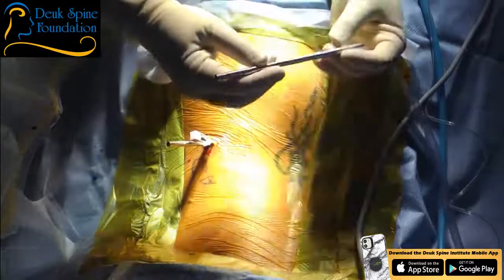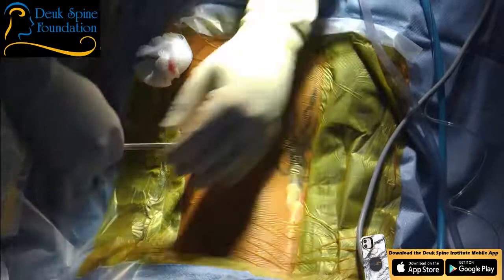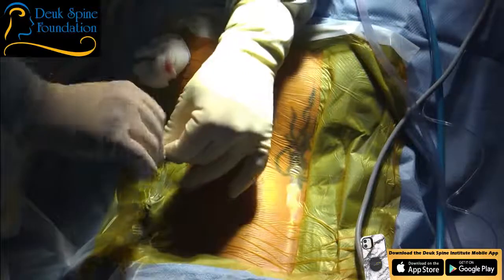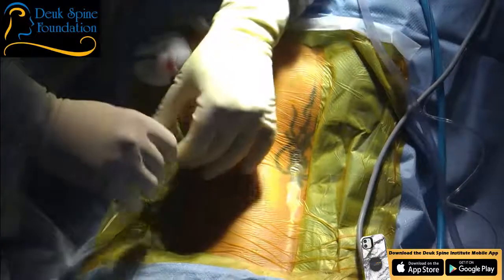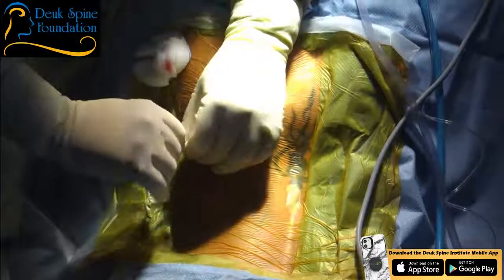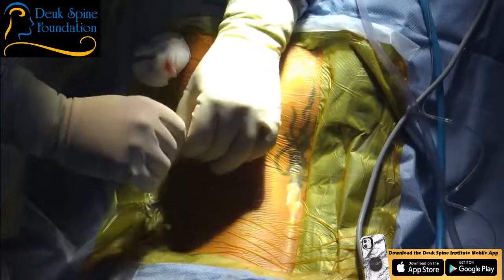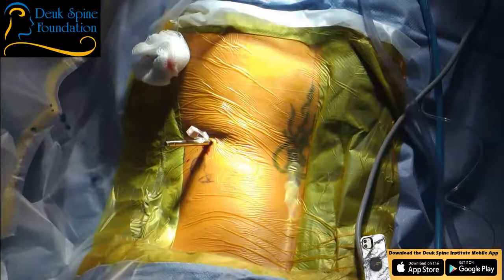So once again, the whole surgery will be done through this tiny metal tube. This creates a passage from the outside world, where we are in the operating room, into the disc, right through the herniation. So there's no damage at all done to her spine. We're not hurting her spine in any way whatsoever. All other spine surgeries are going to hurt the spine because those surgeons are going to be removing bone and ligaments from the spine in order to do their surgery.